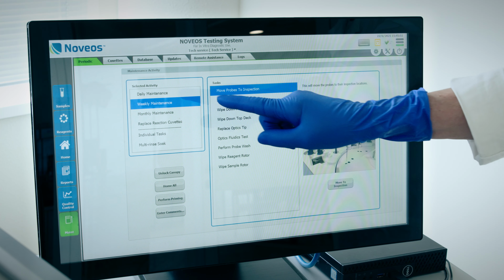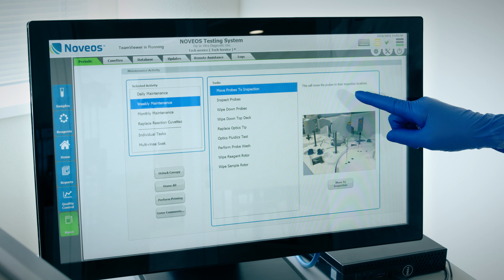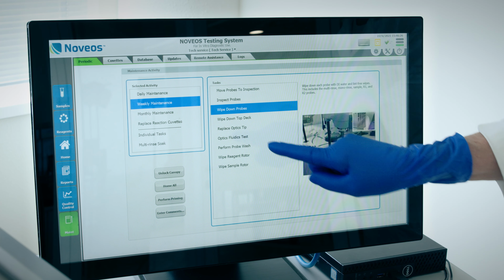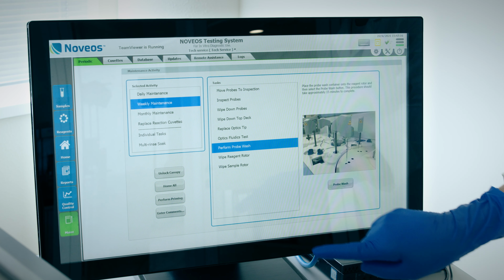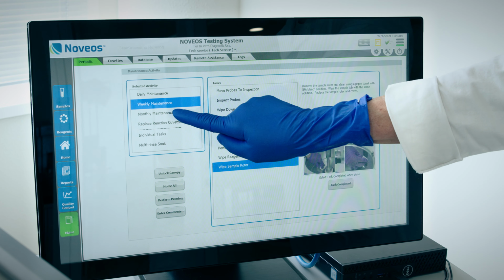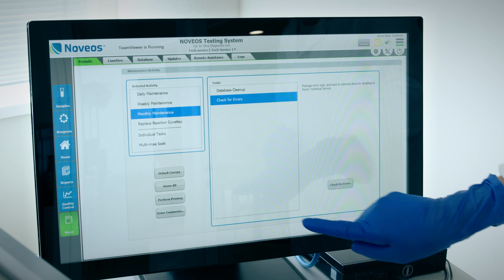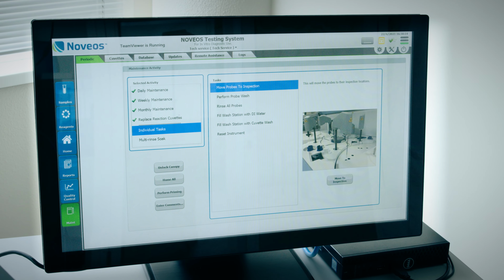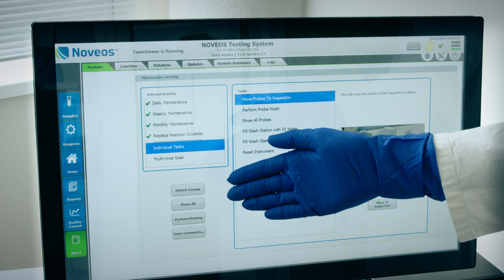The weekly maintenance consists of tasks that are performed by the instrument, but also tasks that require operator hands-on applications, such as cleaning the probes, top deck, rotors, and changing the optics tip. Just follow the instruction on the screen. All in all, the weekly maintenance takes approximately 1/2 hour, but the presence of the operator is not required for all tasks. The monthly maintenance consists of two tasks with regard to the software: a database cleanup and a check for errors. Green check marks indicate that the individual tasks within the maintenance procedures and also the complete maintenance were successfully completed.